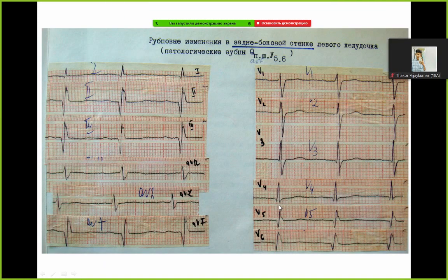This example of scar stage of myocardial infarction of the posterior and lateral wall of left ventricle, because we have only pathological Q. ST segment is on baseline. The T wave is slightly positive in the second standard lead, third standard lead, aVF, V5 and V6 chest leads.